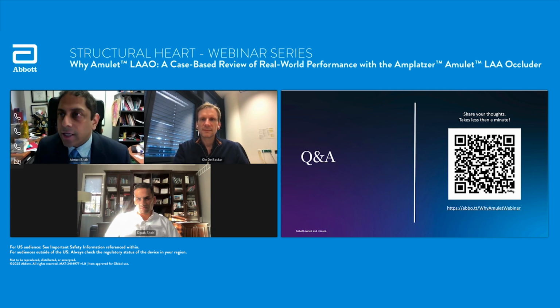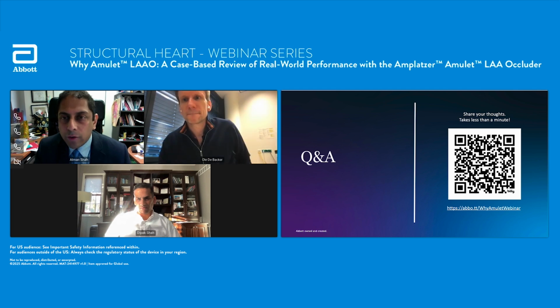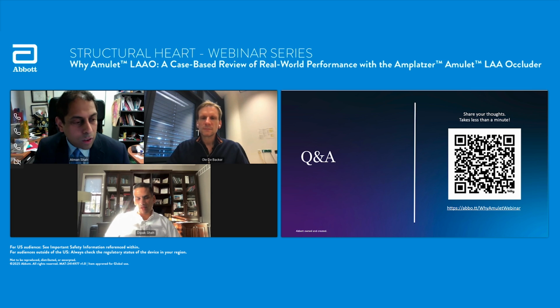That's fantastic. Dipak, if you have like 30 seconds, if you wanted to add anything to that, otherwise we're kind of close to the hour. No, I agree with Dr. Dipak. We still, from a cost standpoint, use TEE a lot more. And again, that's just from a hospital cost standpoint, because 3D and 4D ICE are a lot more expensive.